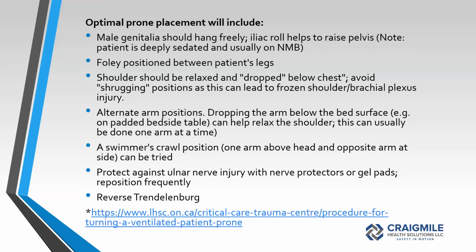One thing we did not mention: when you're using an air transfer device, depending on the style and type, if your patient is greater than 350 to 400 pounds, you can use 2 air canisters, one on either side, which will double the PSI inside the mat, significantly reducing the coefficient of force, making it a lot easier to move that patient. When we're dealing with larger patients, we really want to go out of our way to make sure that the 2 pumps are being used.